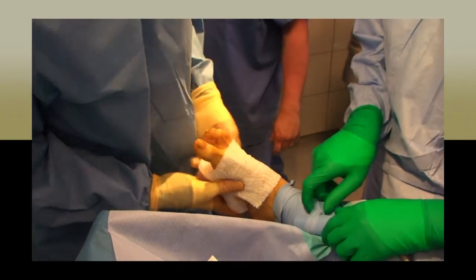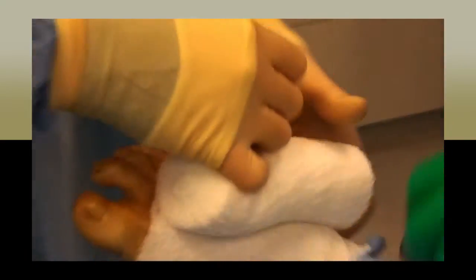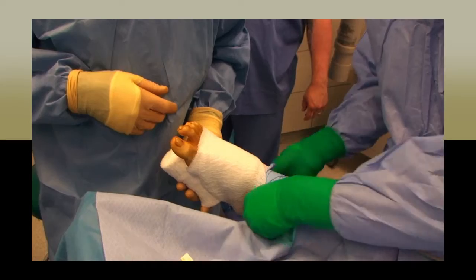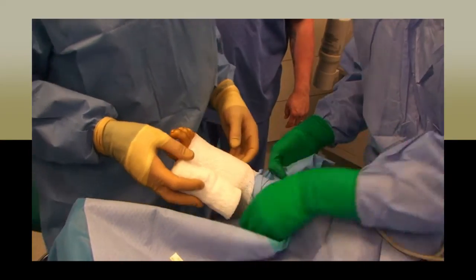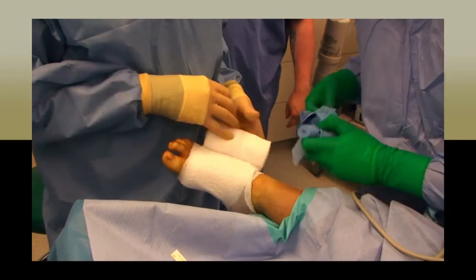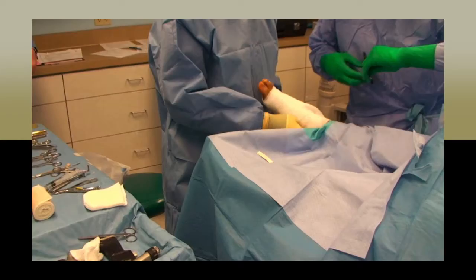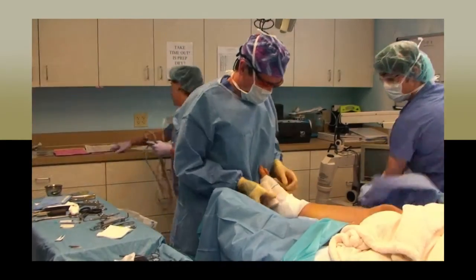You will also be required to cut the tails of the suture, as well as prepare the dressing to be placed by the surgeon. When the physician has finished the procedure and closed the surgical site with suture, you will make sure he has all the materials necessary for bandaging, and he or you will bandage the patient. When the bandage is in place on the patient, and after all procedures are finished, the sterile field may be broken, and you can break out of the gown and gloves.